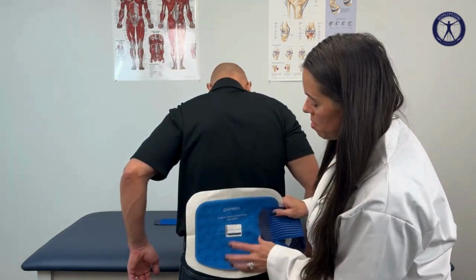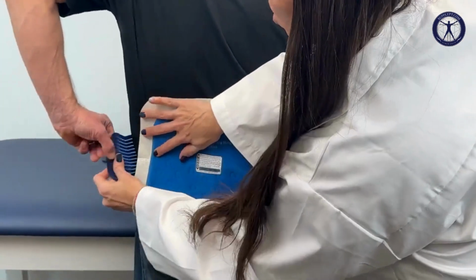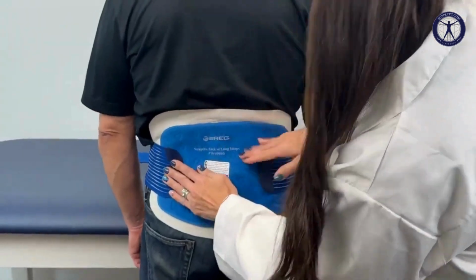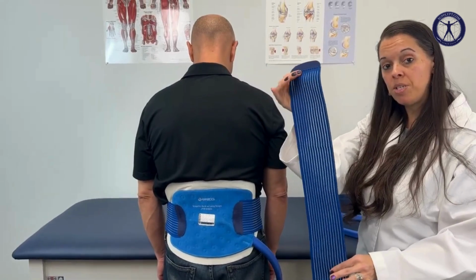So you're going to take the pad and cincher it in the back. Bring the strap around and attach it. And it also comes with an additional strap in case you need an extension. Great job, Michelle, in showing us how to do that.